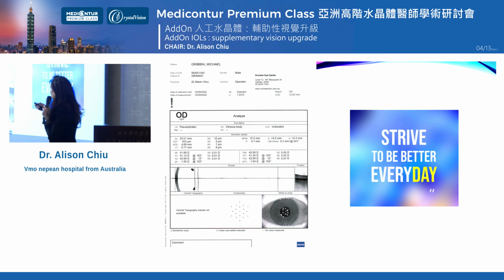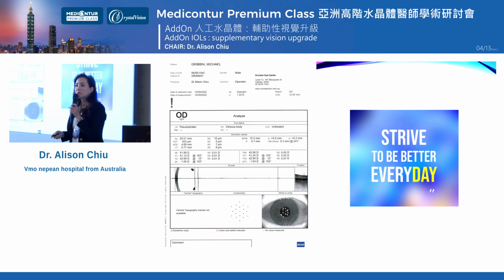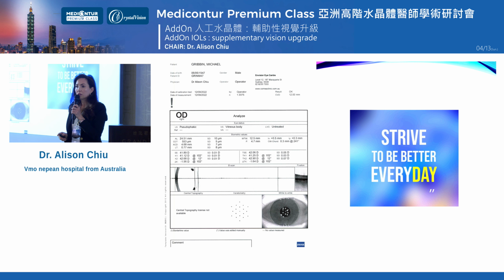And we can see the anterior chamber depth, 4 point something. So I'm thinking, I'm not going to do laser vision correction on this guy. This is an opportunity for discussion with him. How do you feel about wearing reading glasses? I don't mind, but is there an option where I don't have to wear them?